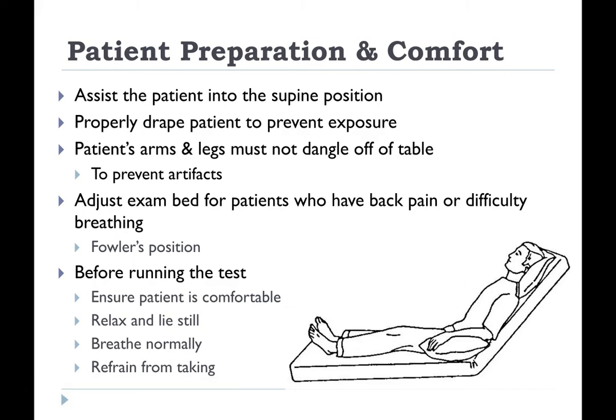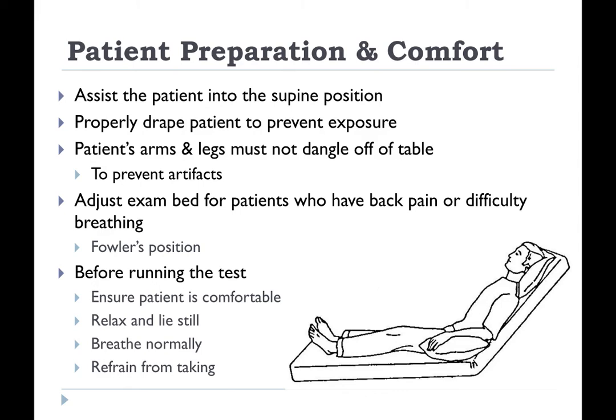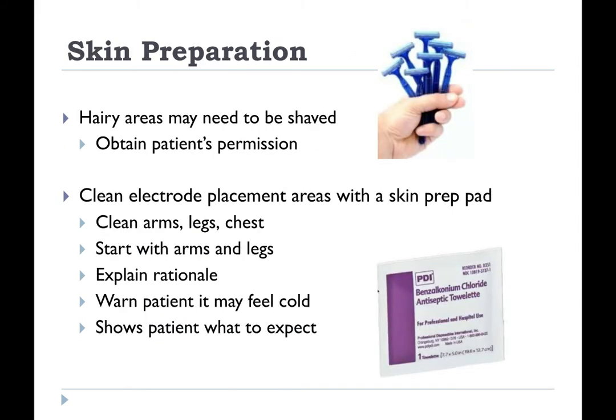Before running the test, you're going to ensure that the patient is comfortable. You're going to ask them to relax and lie still, but breathe normally. A lot of times people will try and hold their breath while they're taking the test, and that is not going to give you a good result. So remind them to just breathe normally, and they should not be talking. So sometimes you have to tell patients, please hold off on talking for now. I'll be happy to answer your questions after the test is complete.